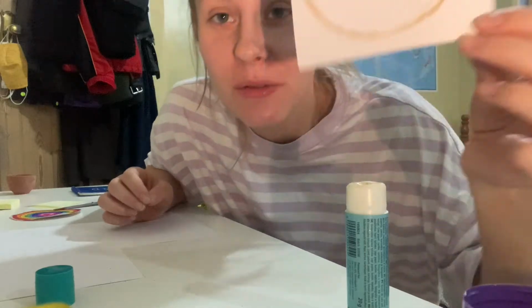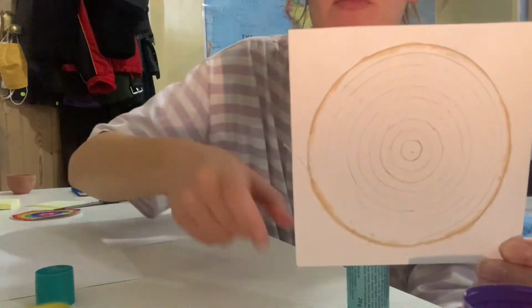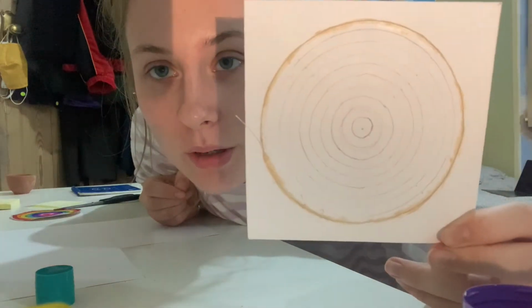Okay, so I've gone around the whole 10 centimeter circle. Me having a dirty makeup brush has probably helped you visualize this, but I am gonna go and clean it now because it's kind of gross. But it's okay, because you can see that I've gone all the way around the circle.